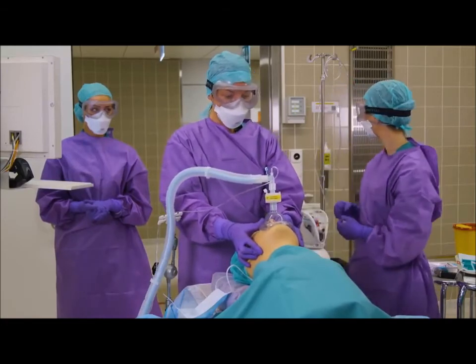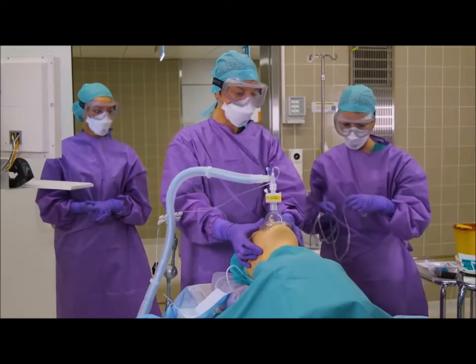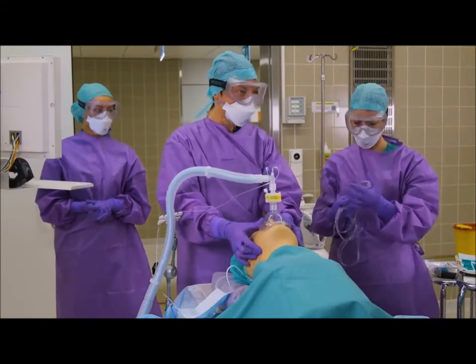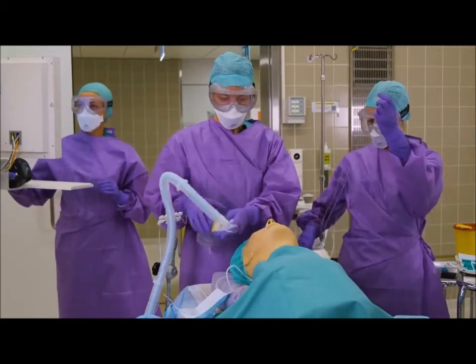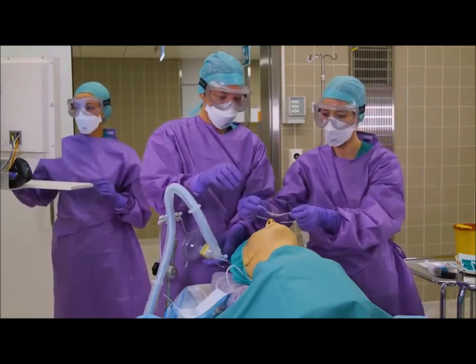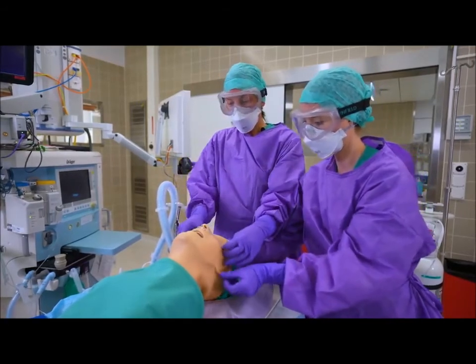Once the patient is adequately breathing, we are utilizing nasal prongs for transport. After the nasal prongs are on, the patient will also receive a surgical face mask.